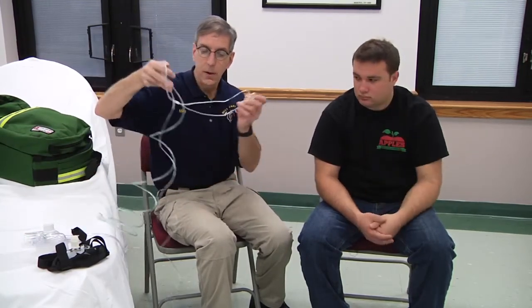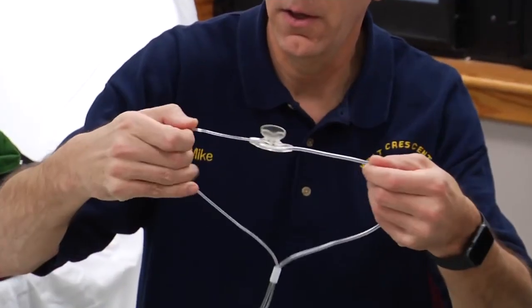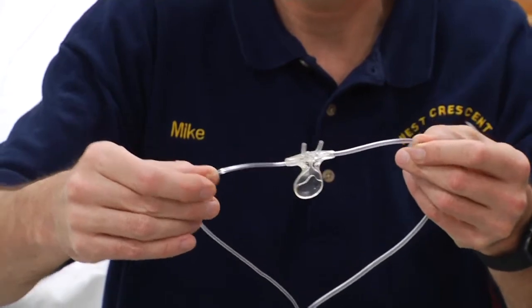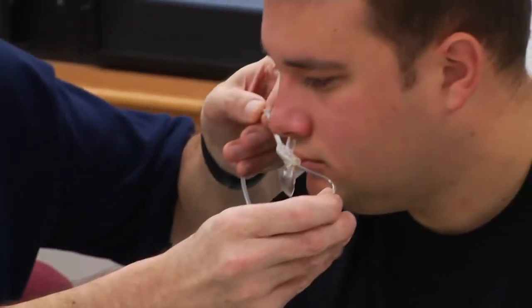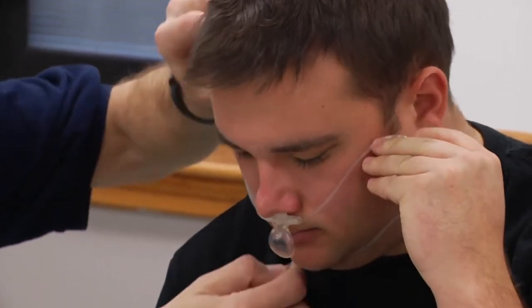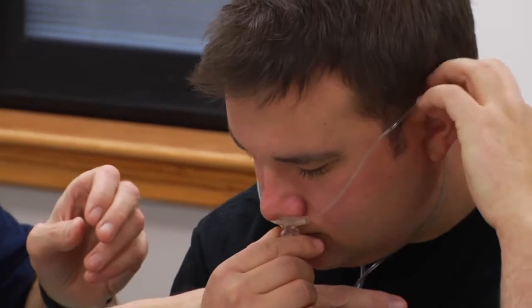And I have here an end-tidal cannula that's a monitor device, but can also administer oxygen to the patient through the monitoring device. So we'll put this on the patient in the same fashion as we would a nasal cannula, and we'll apply the mask over this cannula. Now, a couple things. You notice that this has a pillow, a nasal pillow that measures what comes out of the mouth and allows you to look at end-tidal monitoring with what's exhaled from the patient.